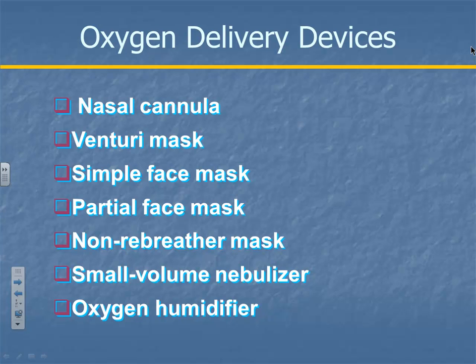A simple face mask, how's that different than a non-rebreather? It doesn't have a bag. So won't that suffocate the patient? No, because it's not sealed. They've got some holes in the side, so they're breathing ambient air along with the oxygen you've got hooked up.